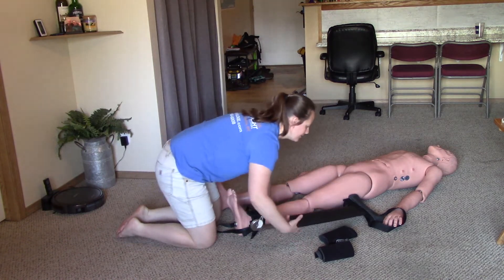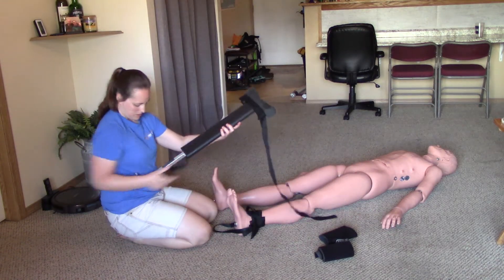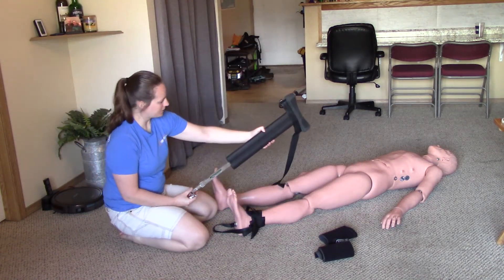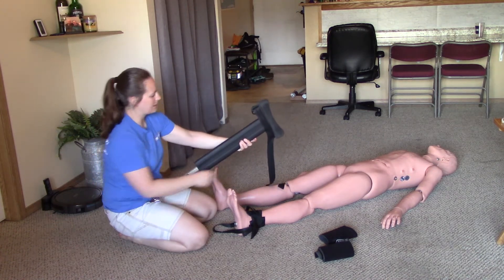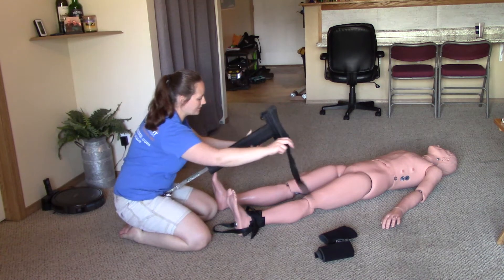We're now ready to put the splint in place. I want the wheel facing the foot and the buckles facing up. It looks like we're in the correct position this time, so I don't need to turn around the padded piece.